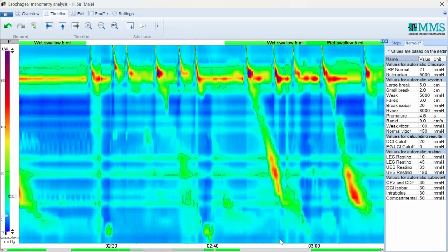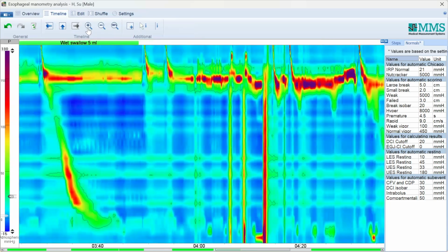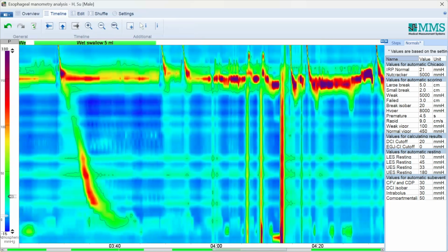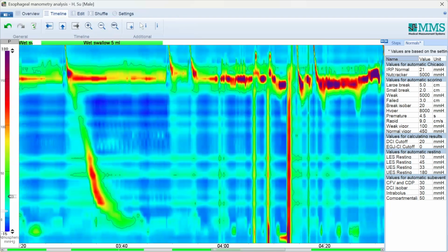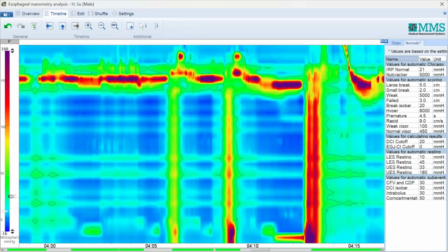And you said before to me, I remember, it's very important that either a technician who knows this or a physician is in the room while this is being done, so that you don't get double swallows or air swallows or hiccups and whatever. So what are the most important artifacts, the things we should always pay attention to, and how can we avoid them?